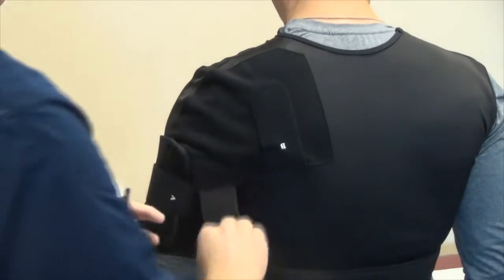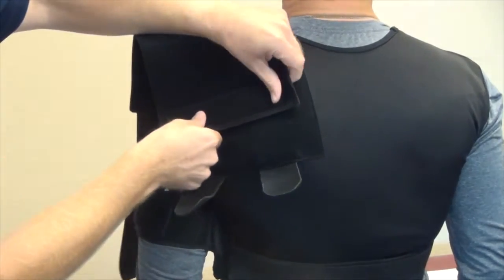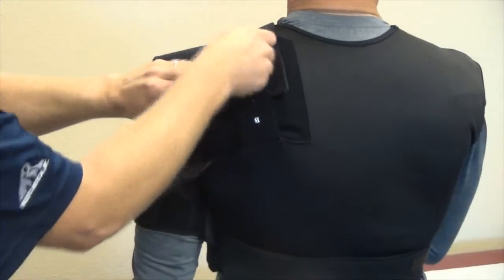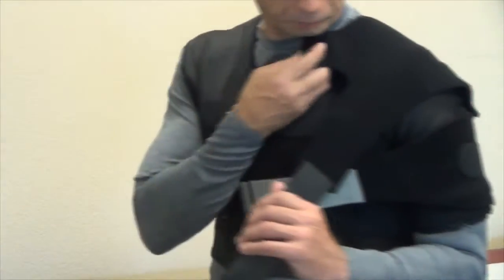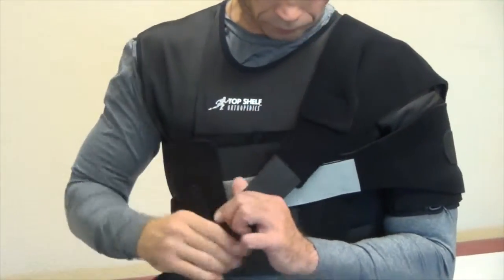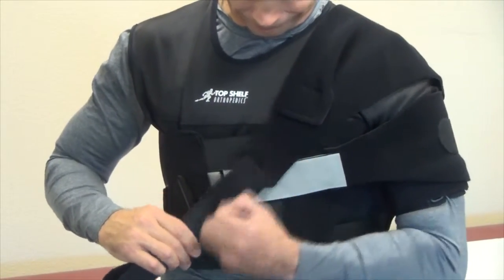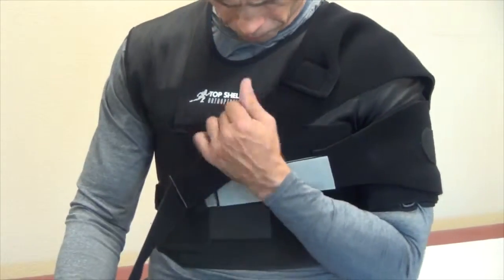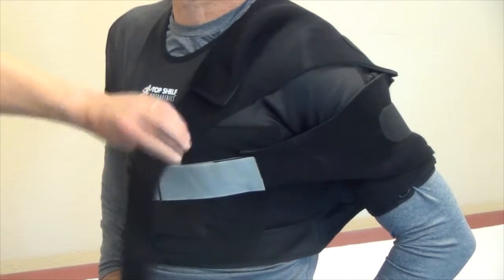The accessory strap labeled B is designed to provide stability to the AC joint and rotator cuff. This strap is affixed in the same manner as the A strap for rotation control by aligning the letters on the back of the garment. Adjust the wrap to cover the shoulder region and provide the most coverage for compression. Affix the strap end to the D-ring without the gray webbing material and secure it back on itself. Cut the strap to length when the fitting is completed.